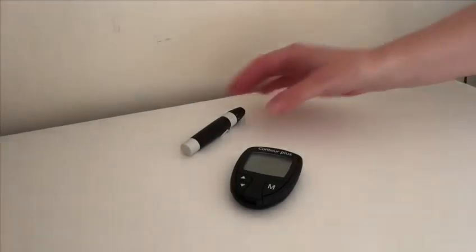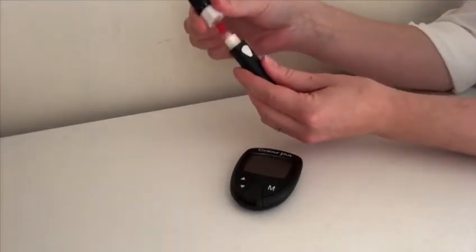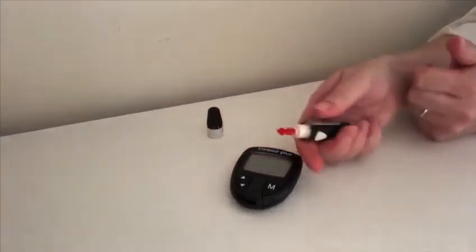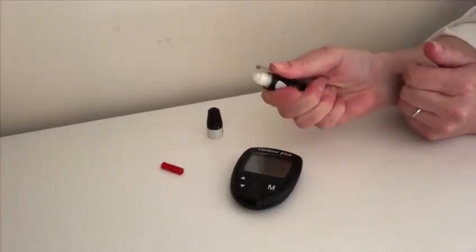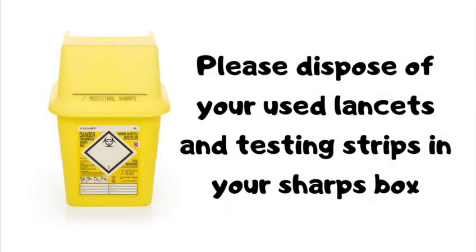To remove the used lancet from the lancing device, twist off the top of the device and push the grey lever forward. Please make sure that you dispose of your used lancets and testing strips safely in your sharps box. Your local diabetes team will be able to advise you on how to obtain one of these.